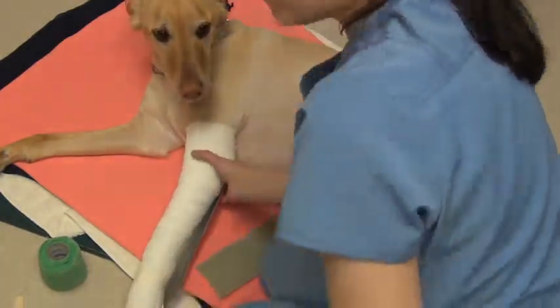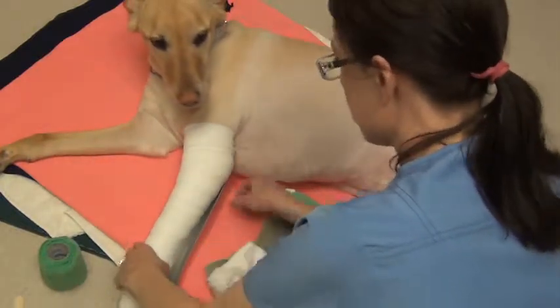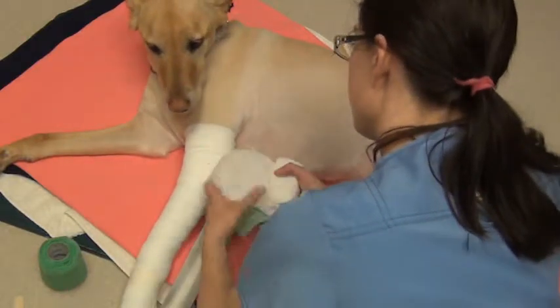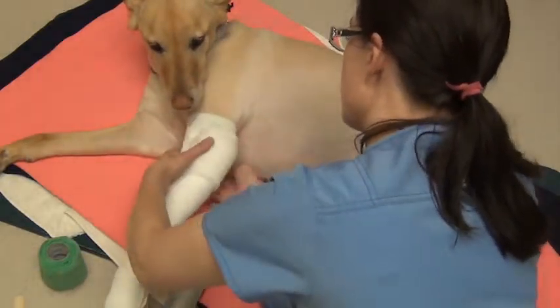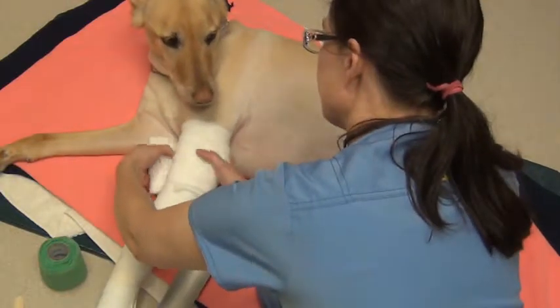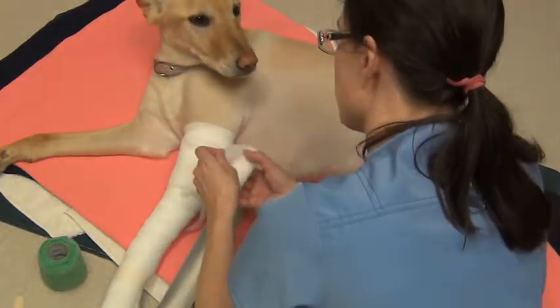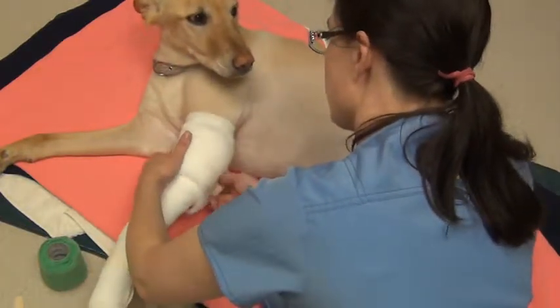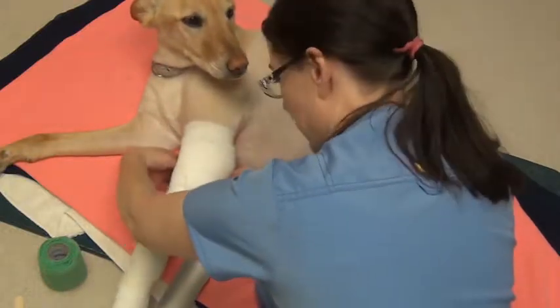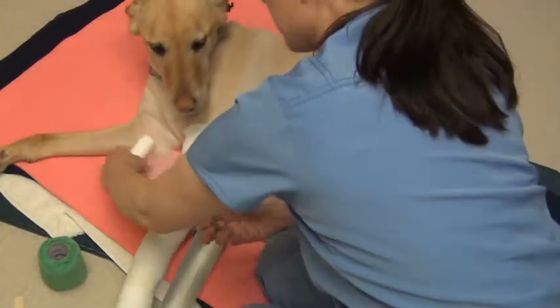So what I can probably do to compensate for the size difference is put a lot more padding at the elbow for her to make up for that. I'm going to put some extra padding here. I don't want anything to dig into her leg. Sweet girl. I'm just going to cut this with bandage scissors.